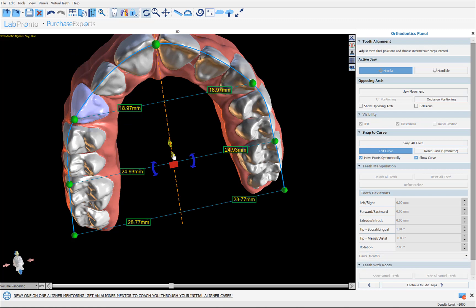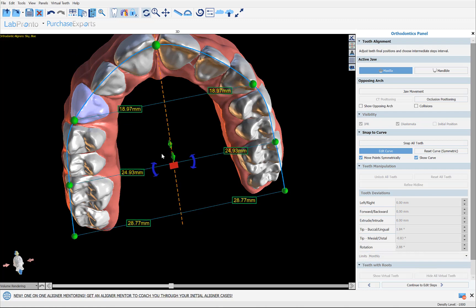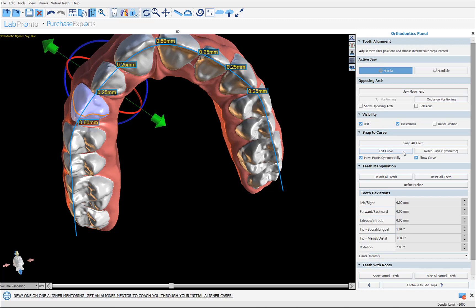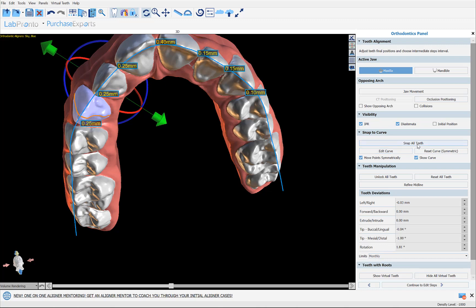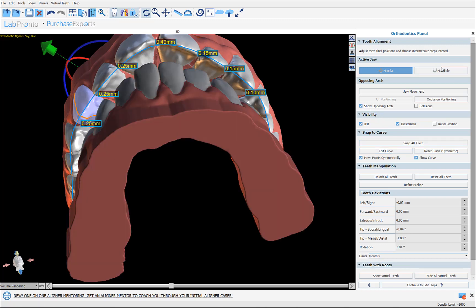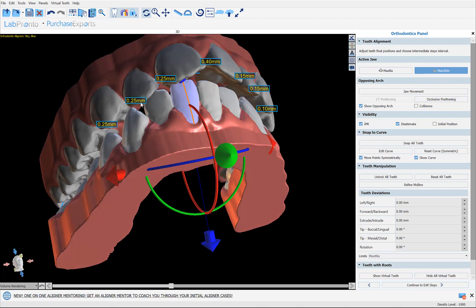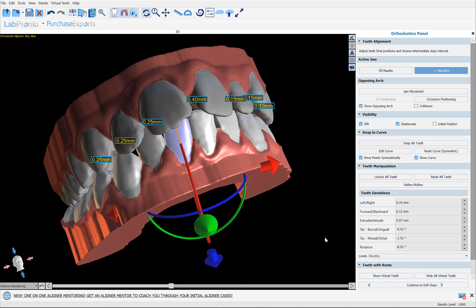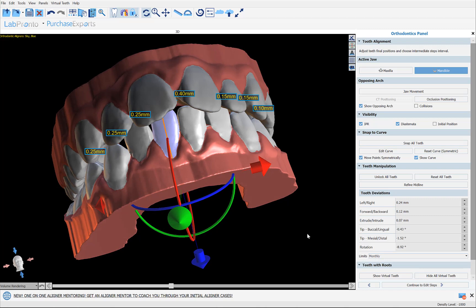In the Edit Curve panel you have the ability to change the height, change the rotation, and if you want a more narrow or different shaped curve you can grab those nodes. There's a checkbox to move points symmetrically. After making any modifications to the curve, turn off Edit Curve and then Snap All Teeth to that curve. You can repeat the process for the opposing arch. For our demonstration purposes, we can say that's sufficient.